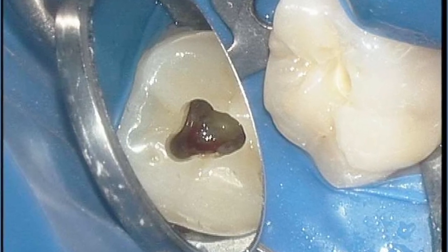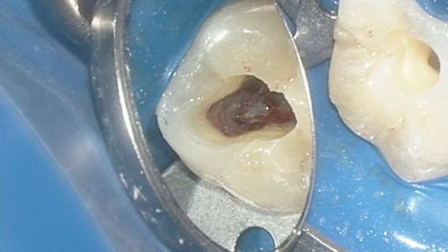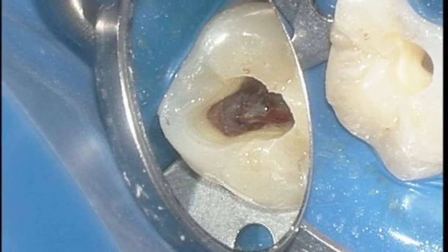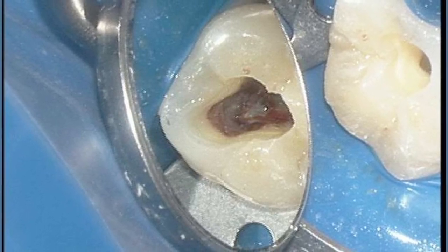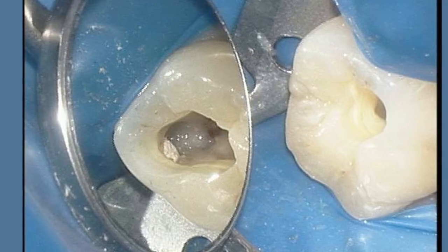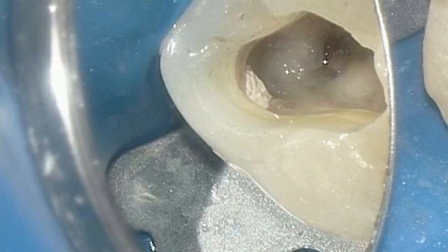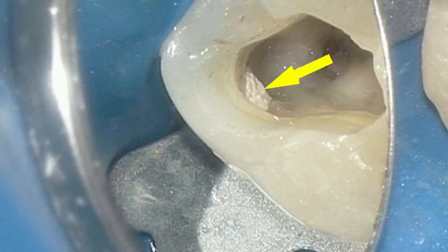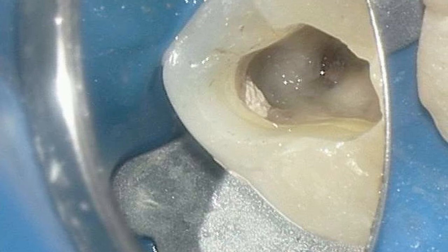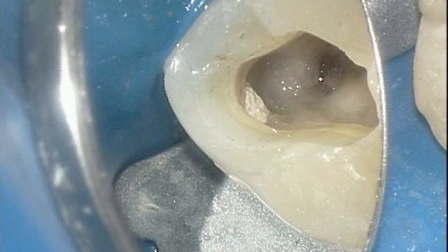This area was curetted out conservatively with the aid of slow-speed size 4 and 8 round burs along with a large spoon excavator until all resorptive defect was removed and the dentinal walls were completely clean. At this point, the internal aspect of the bioceramic root repair material placed by the patient's general dentist could be visualized from the interior of the pulp chamber through the access cavity.